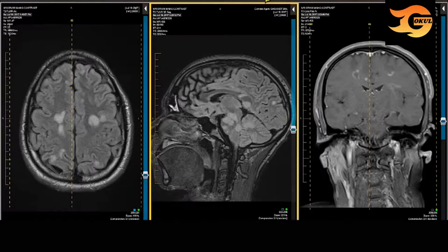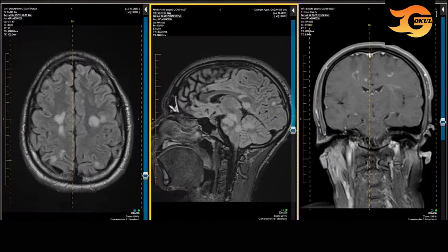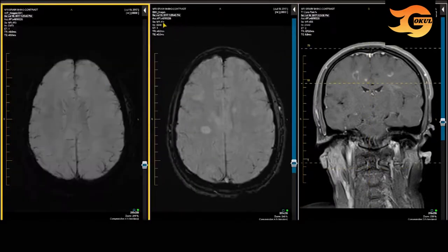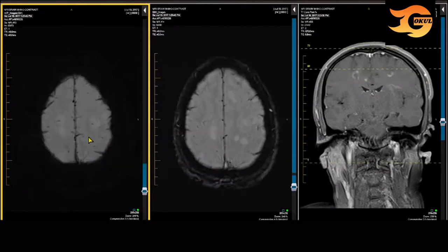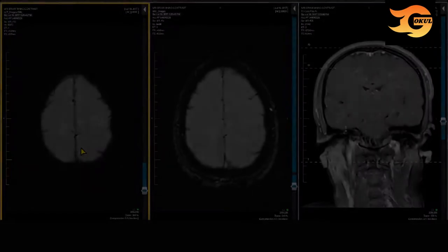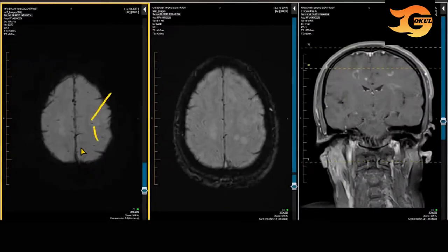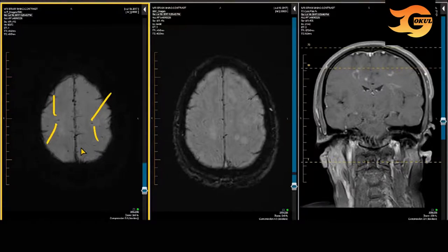This patient also had susceptibility-weighted images performed. You might get a sense here of the central vein identified in some of the plaques with the perivenular demyelination, indicative of multiple sclerosis.